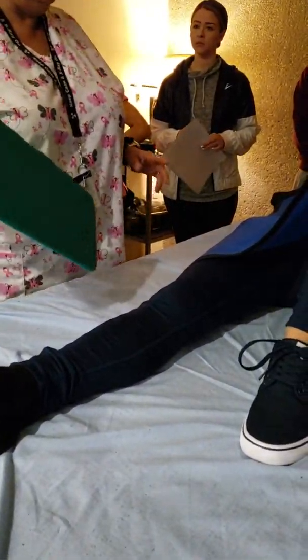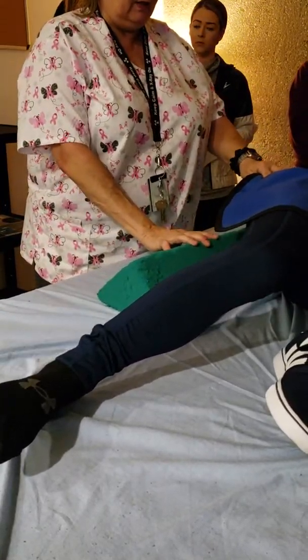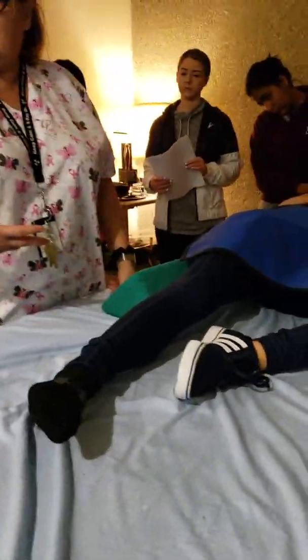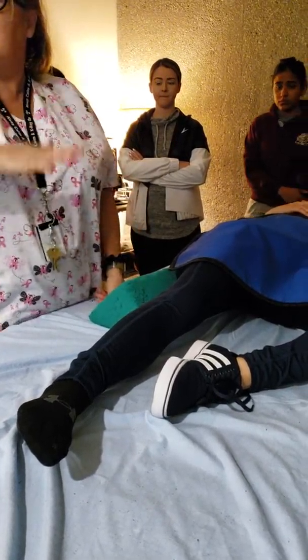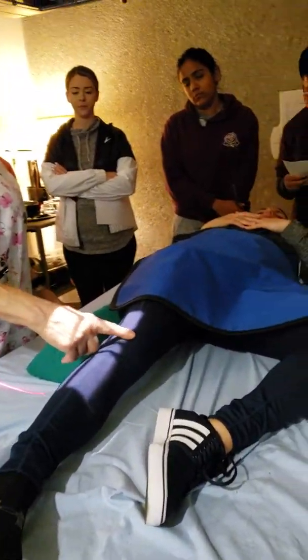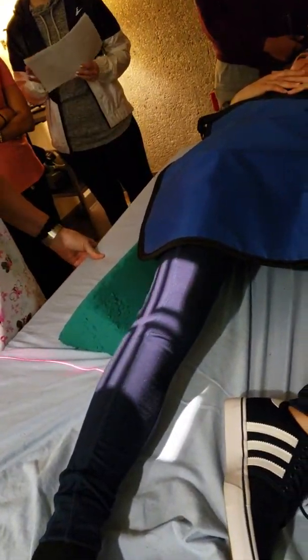So what I'm going to have you do is just turn slightly towards your left side. I'm going to put a little sponge here just to help you be comfortable. Go ahead and straighten out your leg. Now, this causes a lot of stress on the knee, so if she's having swelling or discomfort, you might want to just put a little sponge there so it helps them relax the knee down, because that hurts when you have swelling in the knee. So remember, what does this do to the patella now when we're 45 degrees rotated? Where are we seeing the patella?